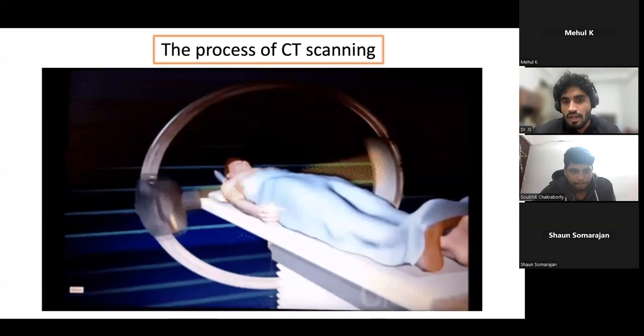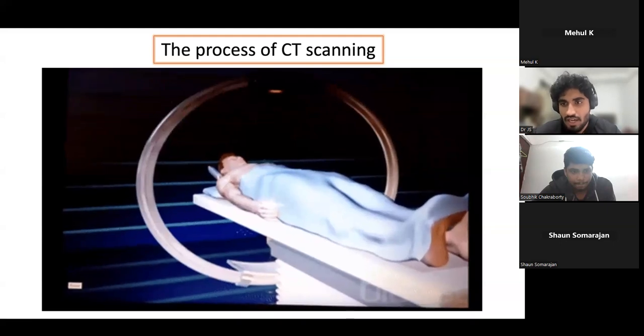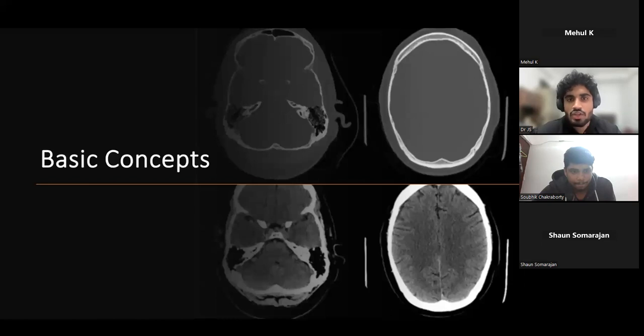We will analyze the sections, and there are multiple terms as well, which we'll learn through this session. So the basic concepts. You are seeing what?